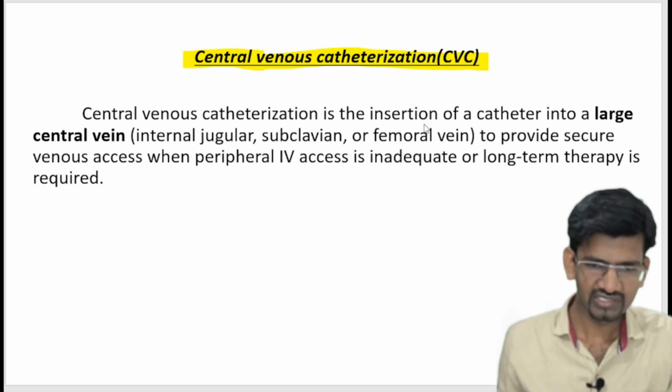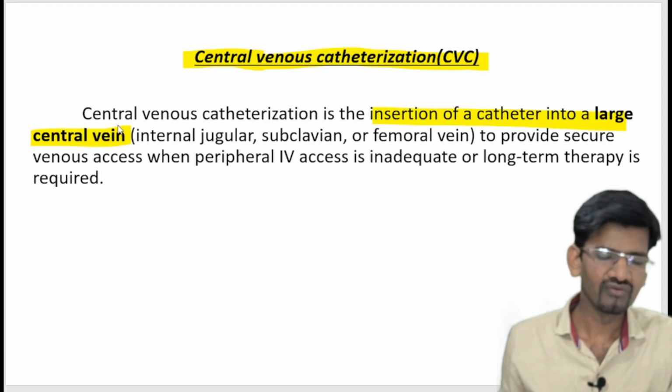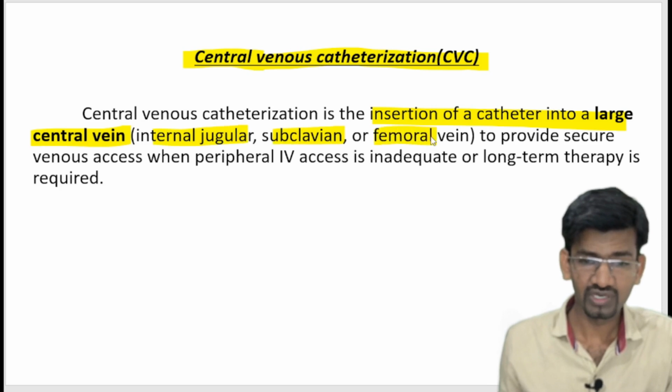Here is the definition: it is an insertion of a catheter into a large central vein. The most commonly used central veins are the internal jugular vein, the subclavian vein, and the femoral vein.